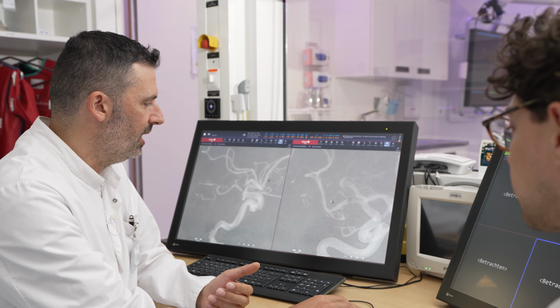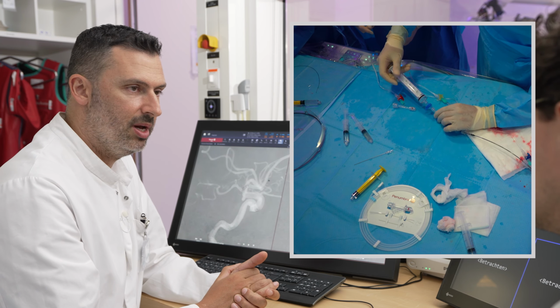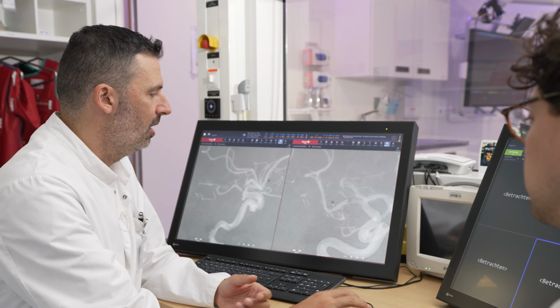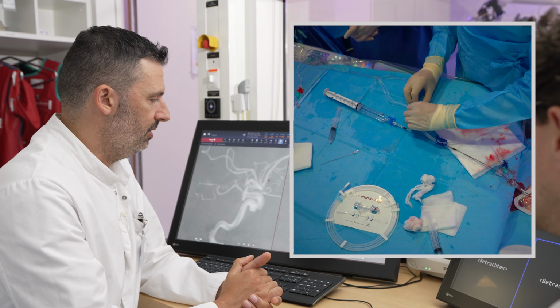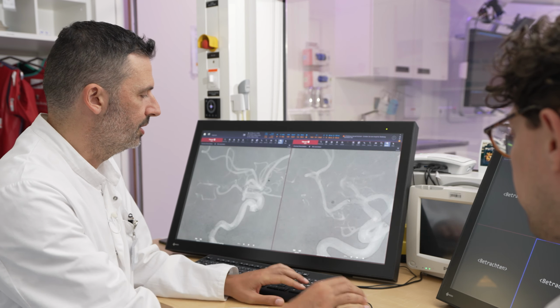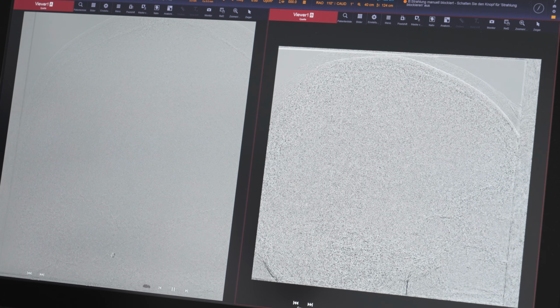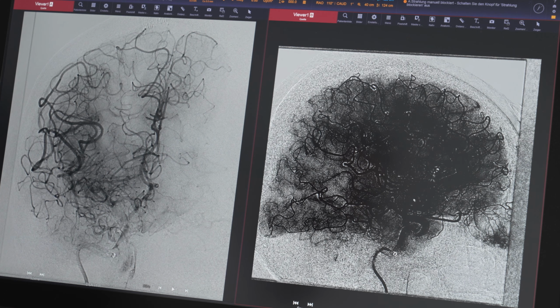So what we did is we had the Vaclok syringe connected to the smaller aspiration catheter, and after 2 minutes we retrieved into the big aspiration catheter where we had the pump aspiration. So you have continuous aspiration there, and you're able to retrieve the clot safely. You can see the result on the final angiogram, where you have a really nice reperfusion of this superior trunk.